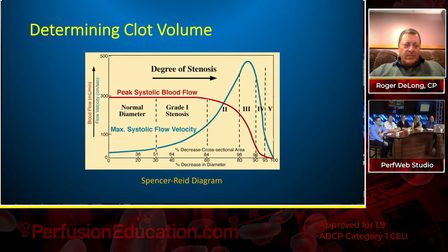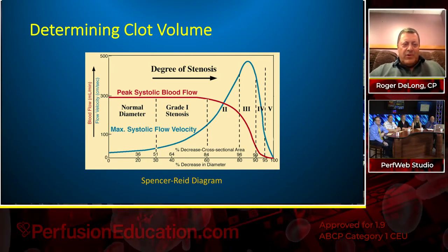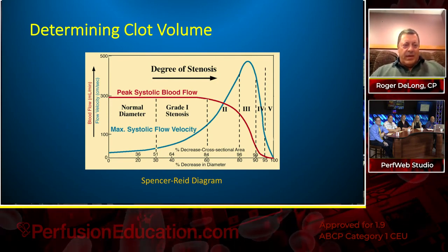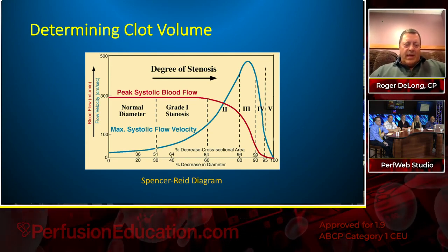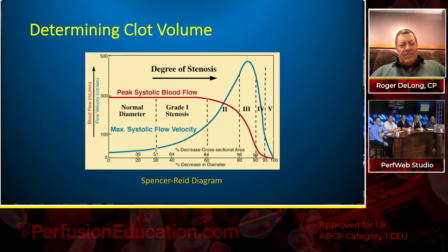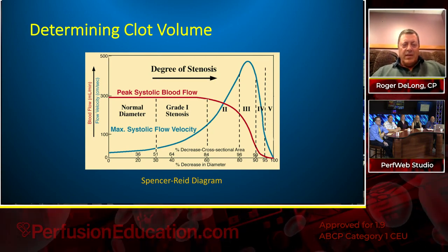We're ready. Across the bottom, you can see the percent of occlusion. This would be true whether it's a vessel, an oxygenator, anything, a garden hose, it doesn't matter. The red line shows the performance of flow as the occlusion increases. And you only have a steep falling off once you get up around the 75-80% range. Next picture.